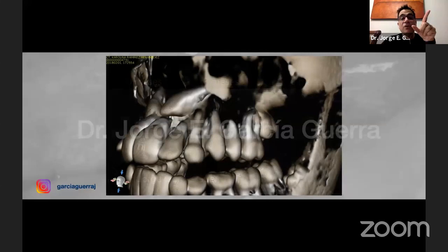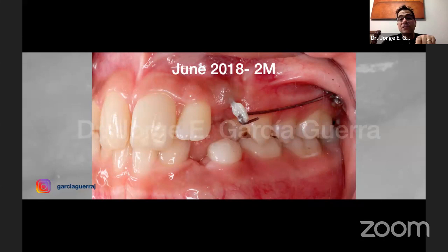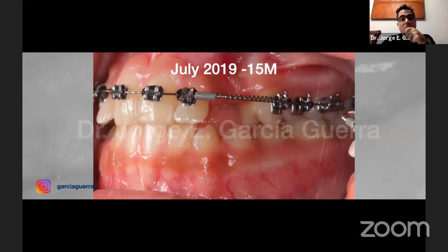Now this is the one on the left. You can see that it's way up higher around the apex of the central incisor. So we did the same. This is 2 months, a picture, but it didn't erupt, and obviously the chain tore off. So what we decided to do here was to open the space first. So we put the brackets on and we started opening the space. This is 15 months later.